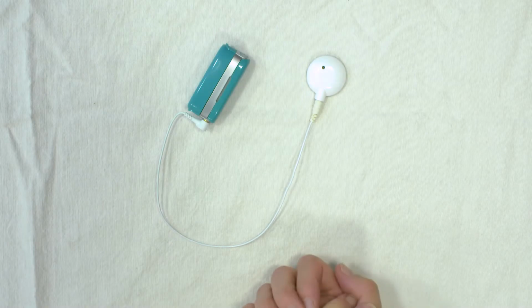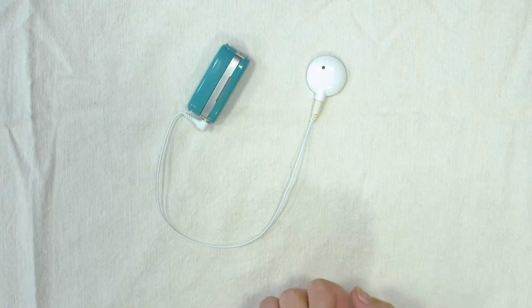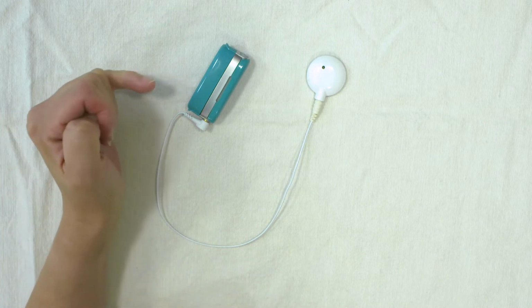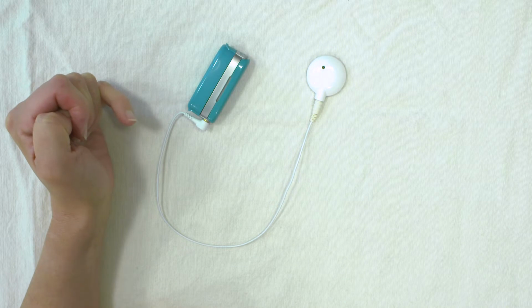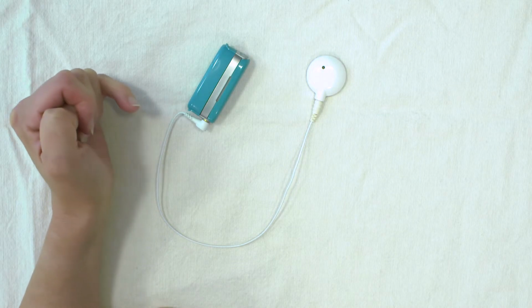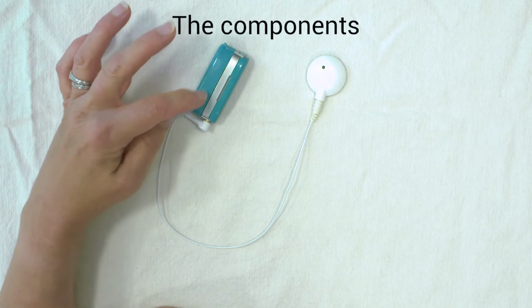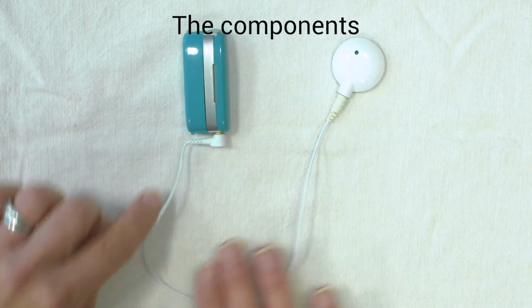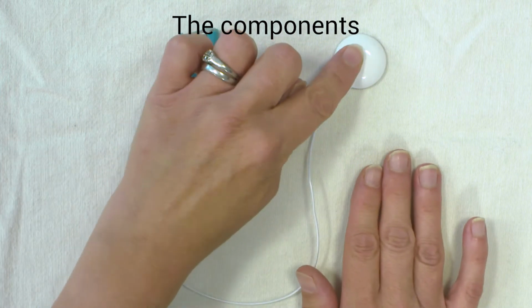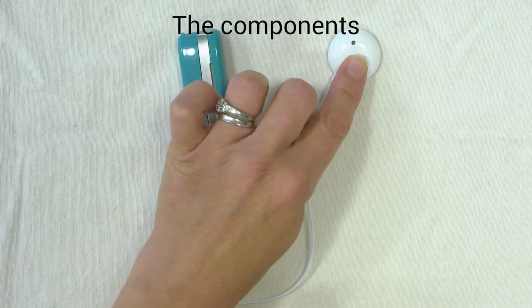This is the Advanced Bionics Neptune speech processor. It's a fully waterproof option for patients. I'm going to run through how to troubleshoot and take the processor and pieces apart and put them back together. First of all, this is the battery compartment, this is the processor, this is the lead, and this is the coil that transmits the information across the skin to the patient's implant.